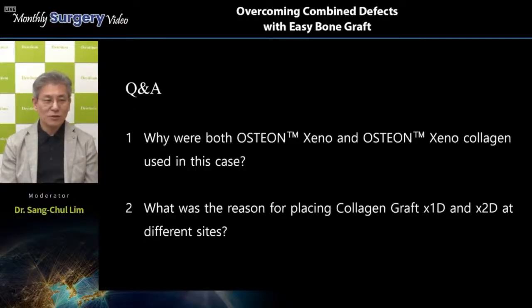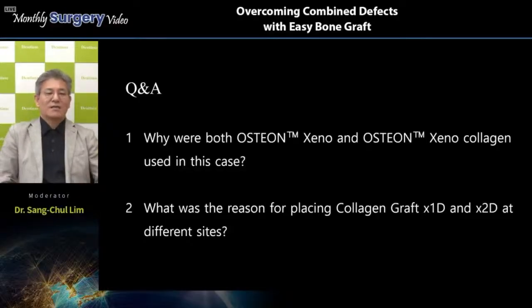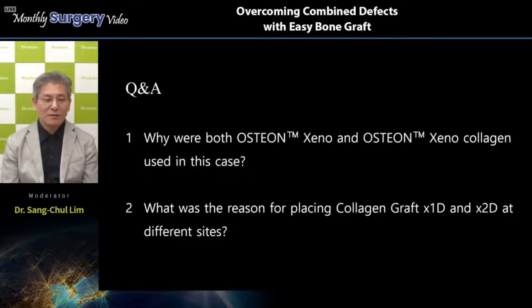Okay, let's move to number 2. What was the reason for placing collagen graft X1D and X2D at the different sites? Generally speaking, X1D is preferred. For me, actually, I prefer to use X1D on the ridge and socket preservation case, because X1D is a little bit easier to manage. The stiffness is moderate. So after soaking with blood, it is very easy to handle and cover all these ridges, including the socket area, and easy to cover all this exposed extraction area. So for me, collagen graft X1D is preferred on the extraction socket side.